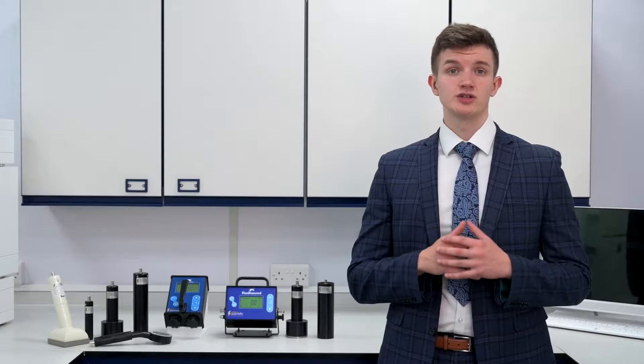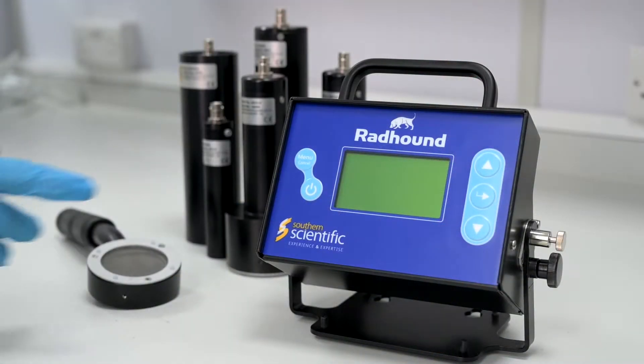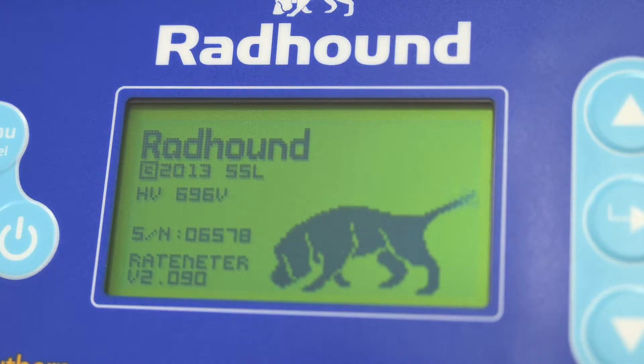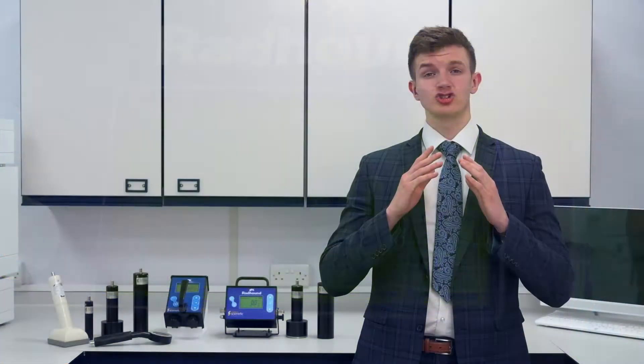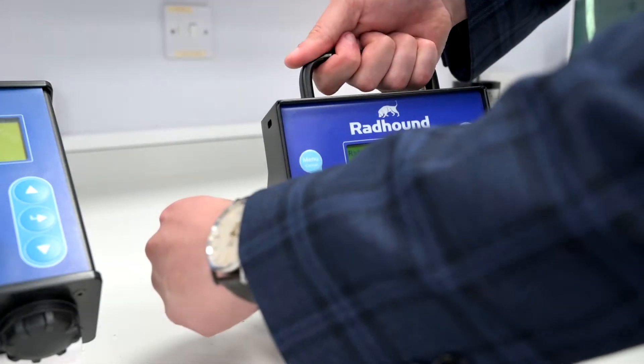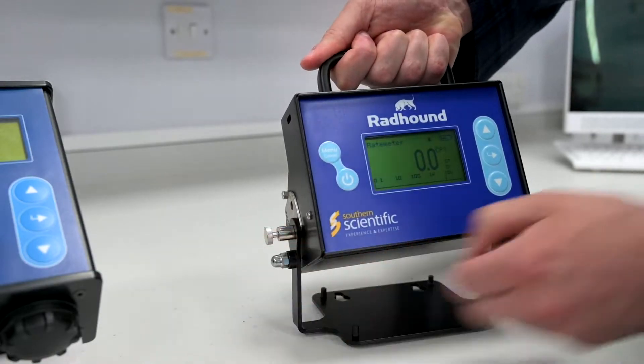Large buttons are used to navigate the menus and settings, so you can be guaranteed that nothing will interfere with your use, be it leather gloves out on the field or nitrile gloves in the lab. It is extremely versatile in this application, with the ability to be used as a mobile instrument or as a fixed unit.